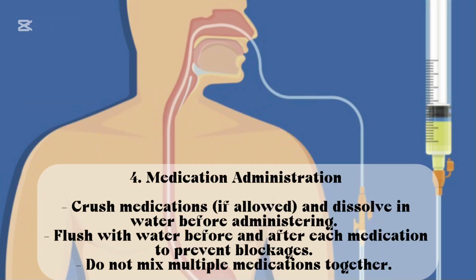4. Medication administration. Crush medications if allowed and dissolve in water before administering. Flush with water before and after each medication to prevent blockages. Do not mix multiple medications together.